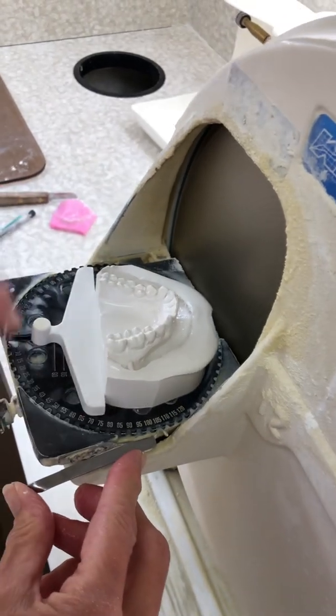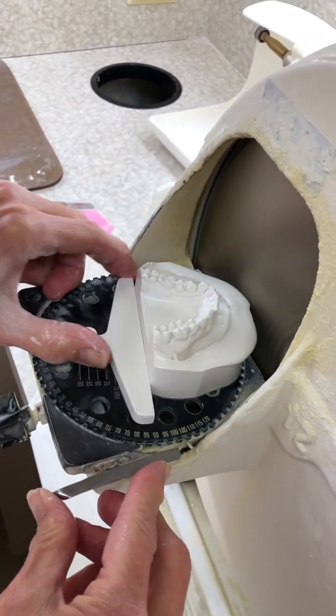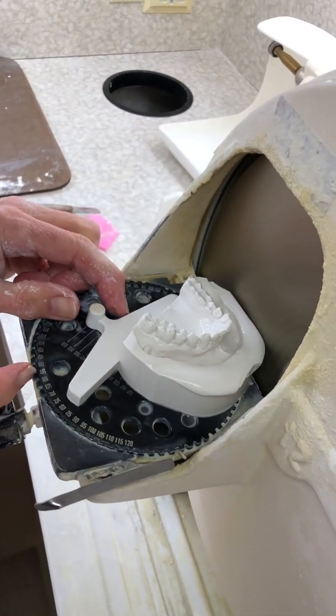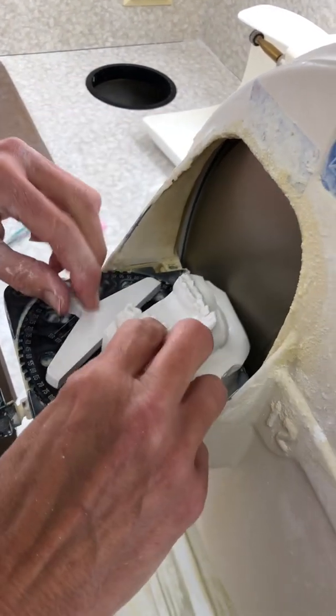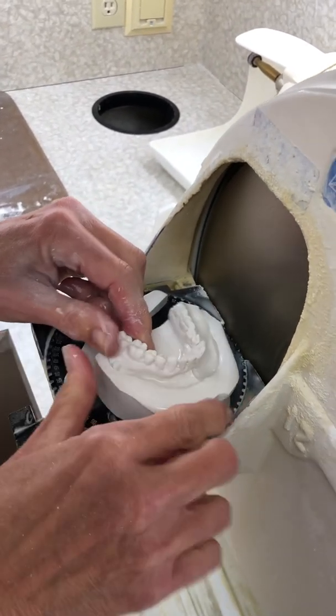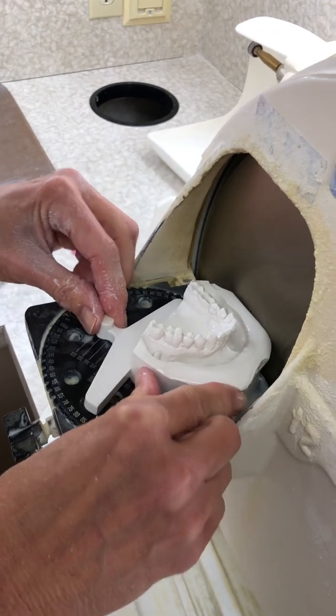Turn it on here. I want to go to 55. So I just get my measure here. So 55 is there. And all we're going to do is push in, and we want to go to the bottom of the labial vestibule, all right? So let's go.